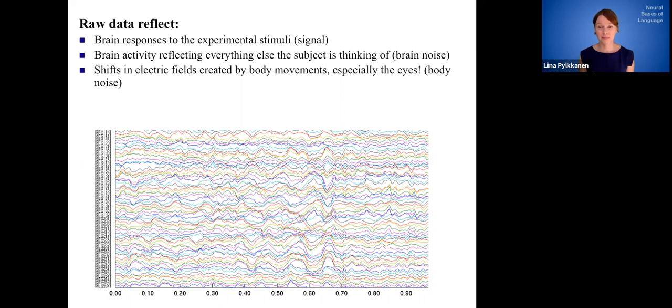And one body part that is moving, even if you're trying to be really still, is your eyes. So if our eyes are open, we can't go without blinking for too long. We can keep our mouth shut much more easily, but the blinking is probably going to be happening. So we need to worry about those kinds of what we call artifacts.